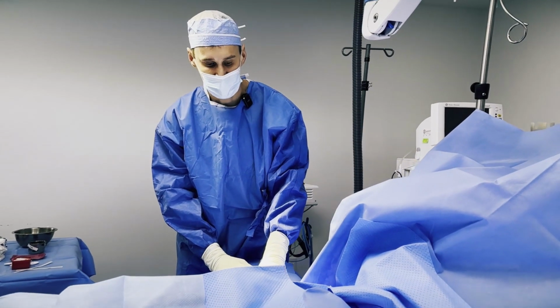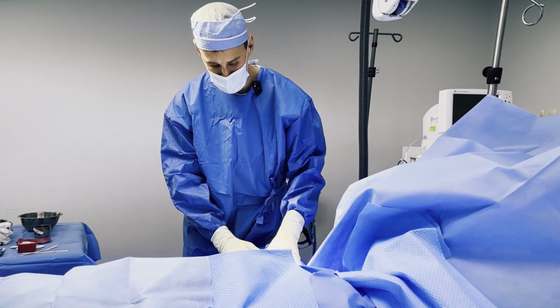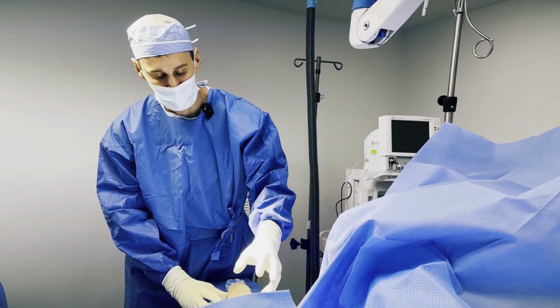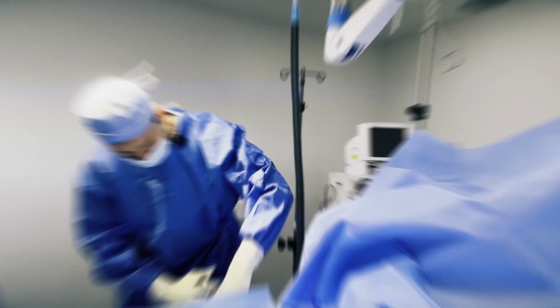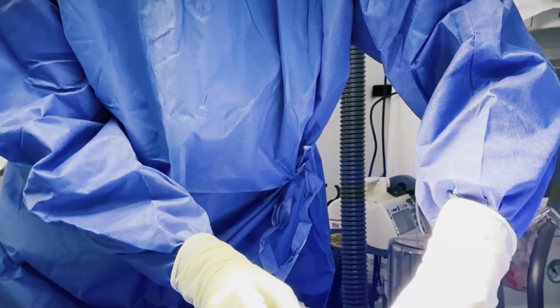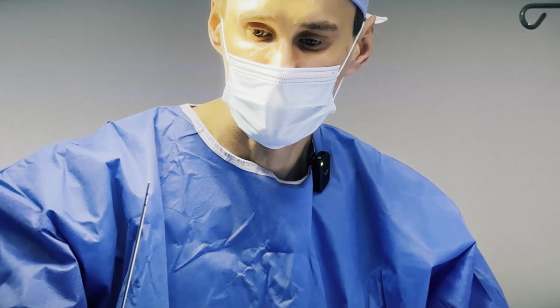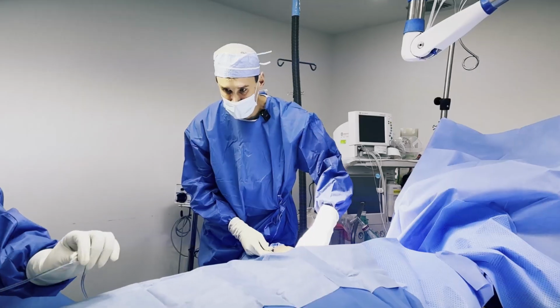The patient is all prepped and draped, ready to go. Our patient is awake, right? You're there, Mary? She's awake. She's comfy. So we're going to make little pokes in the skin and infiltrate the solution to numb it all up. Then we'll start with the fat removal liposuction, and then we'll do the skin excision. We use a special circular little tool to create a little poke in the skin. Boom. The patient doesn't feel it. And then we're going to use a blunt hollow little tube called a cannula to inject the numbing medicine under the skin.